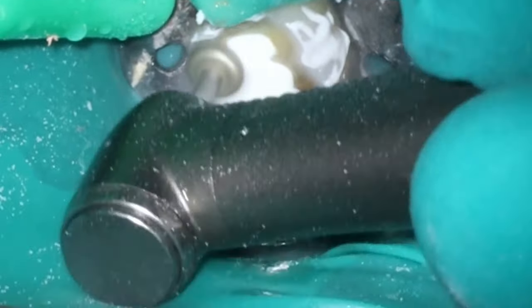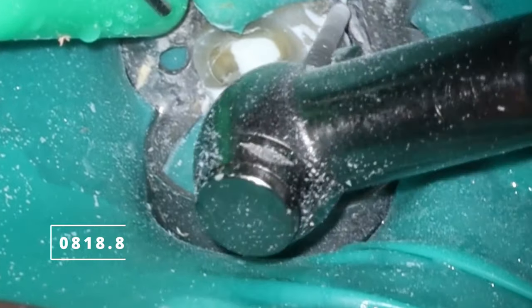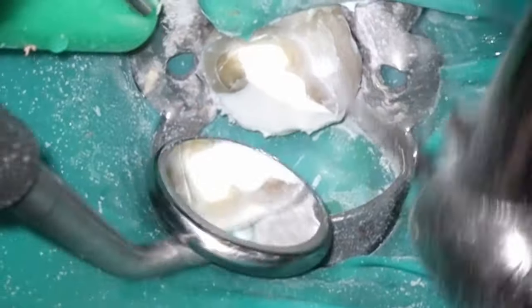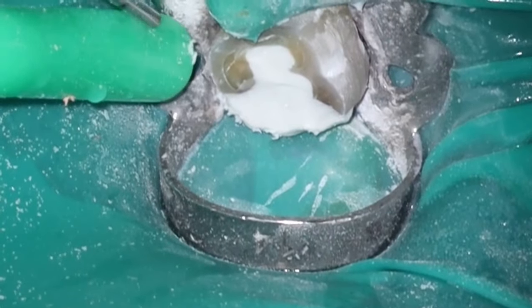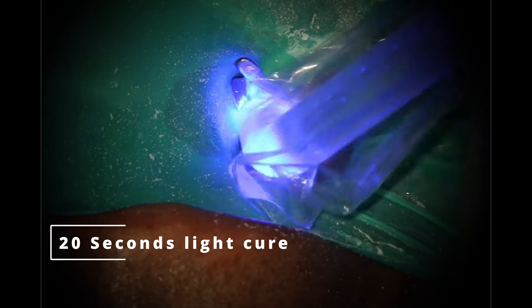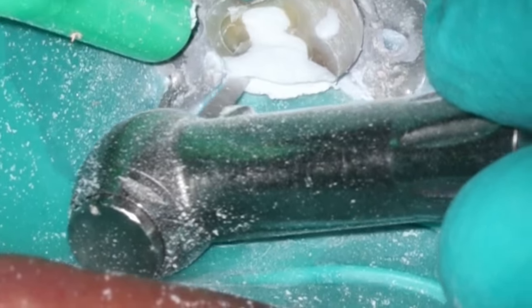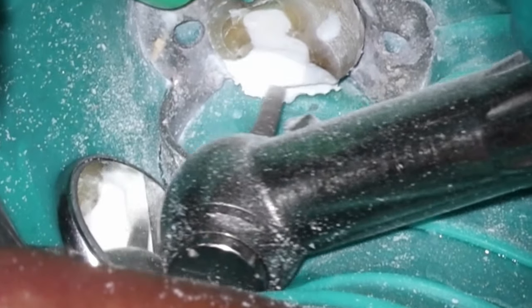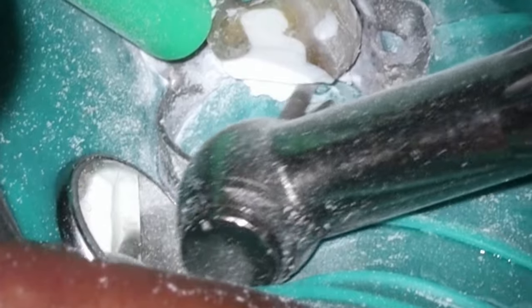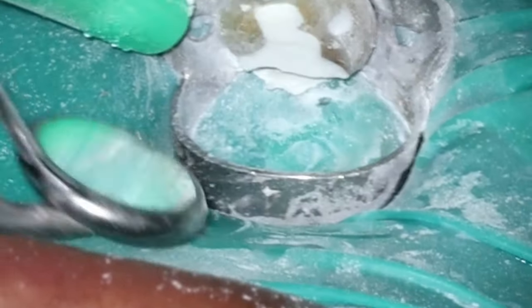This is a dual-cure material — it will set up eventually. Full hardness takes about six minutes. When I go down to do the actual prep you'll notice it's still soft, so you can go back in for another 20 seconds right on that area to make sure it hardens up nicely. You'll actually feel when you put the burr into it whether it's soft — and you don't want that to be the case. Going through here doing my prep. Normally I like to leave everything flush, but in this case his gums had already healed up to where they're going to be.